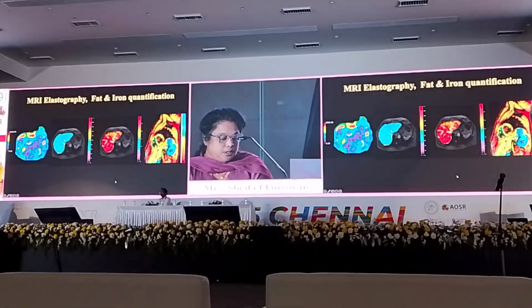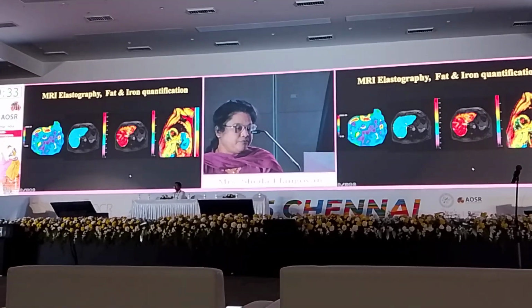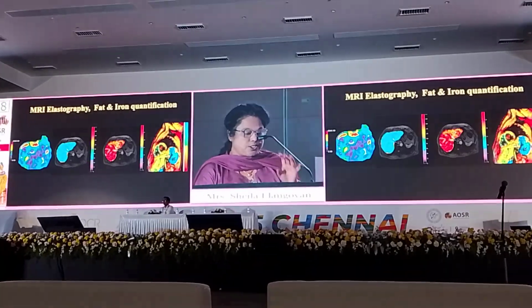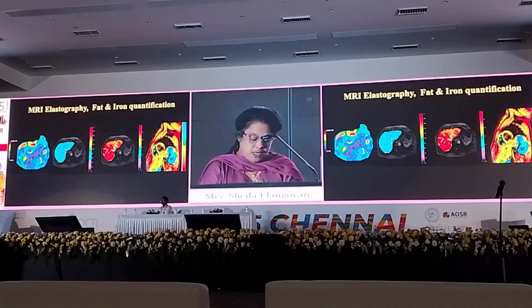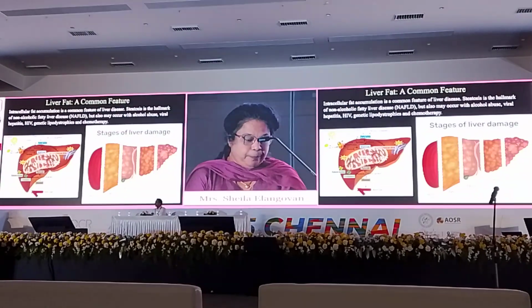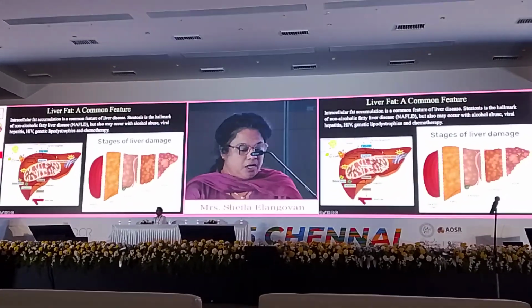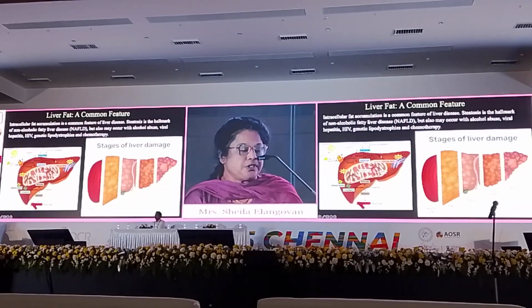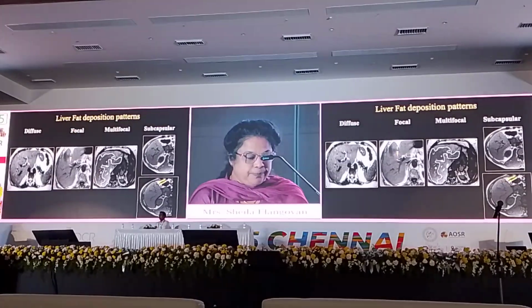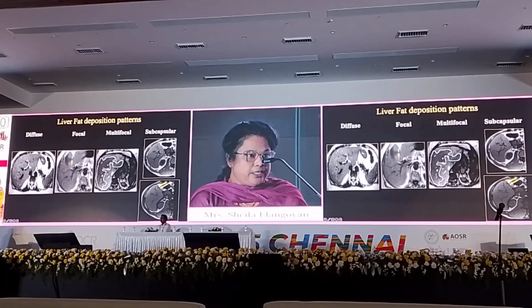So it's very important to know about hepatic iron and fat content and its grading, and how to do the post-processing for the technologists, and also about MR elastography techniques, which play a major role in diagnosing and managing these diseases. So, intracellular fat accumulation is the hallmark of liver diseases, and staging the hepatic steatosis is very crucial for its management. If you see here, the different patterns of how the fat deposits in the liver.